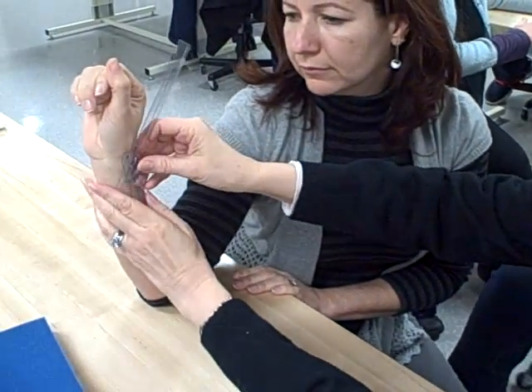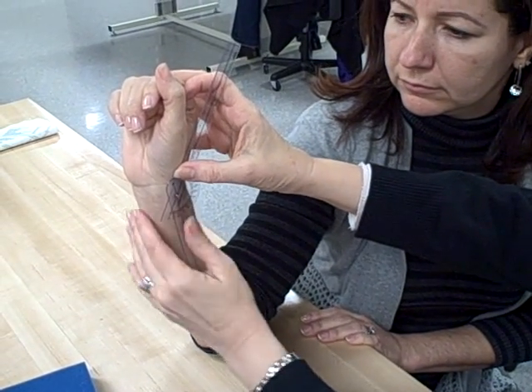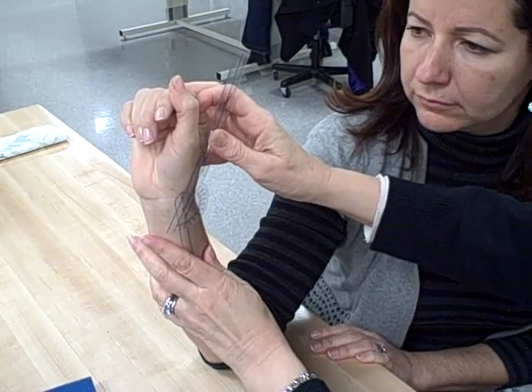Or we can line it up with the second metacarpal, where I'm going to feel exactly where it is, and use the radius and the second metacarpal.